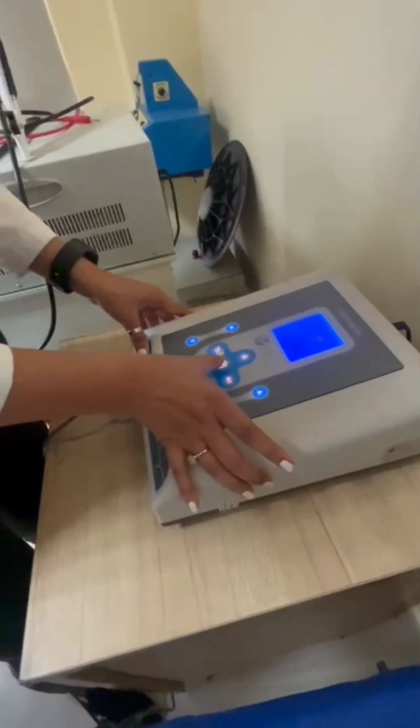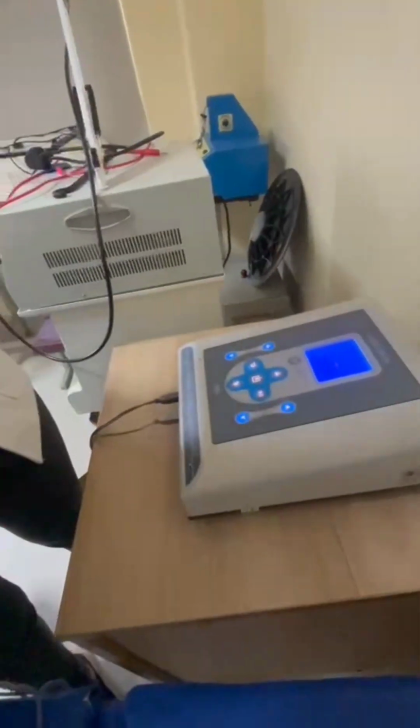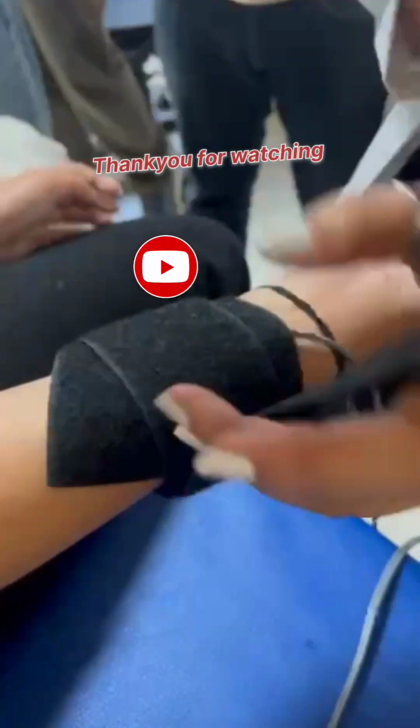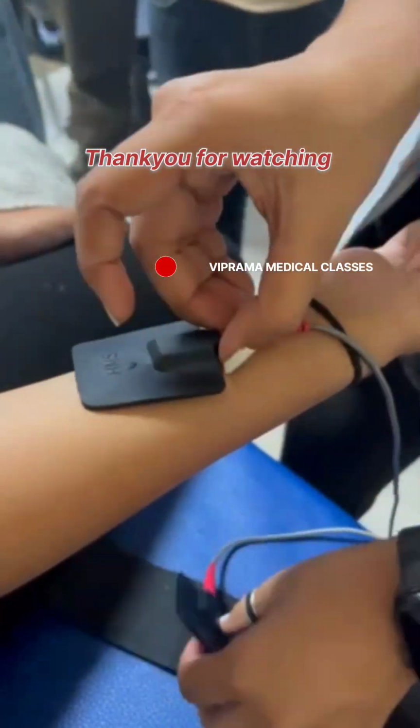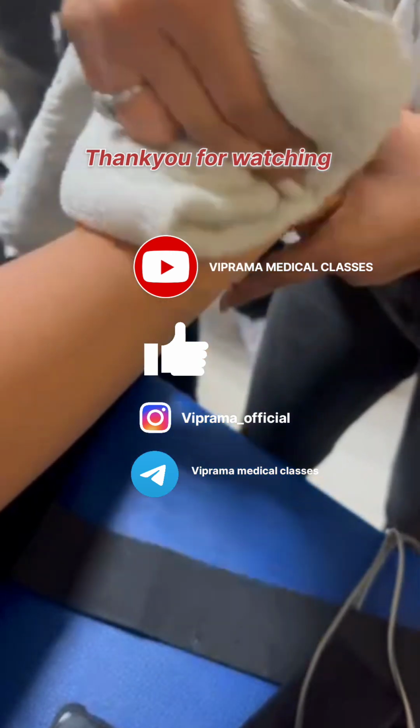After completing the time duration which we set on the modality, we have to stop the modality, unwrap the band, and clean the electrodes and the patient's hand gently.